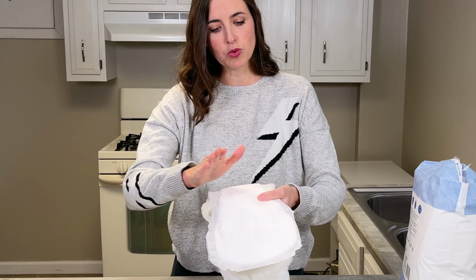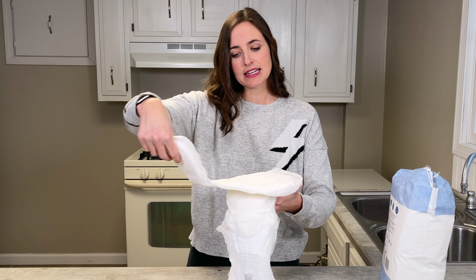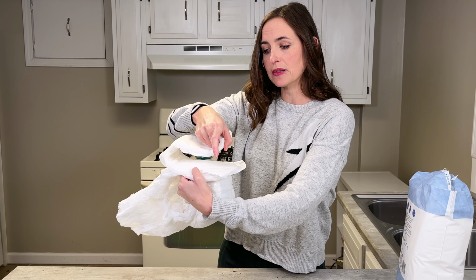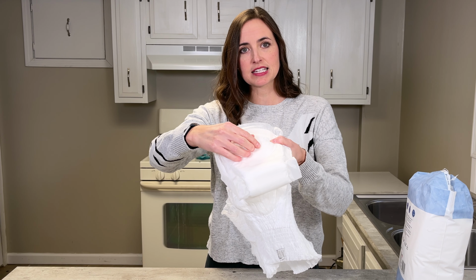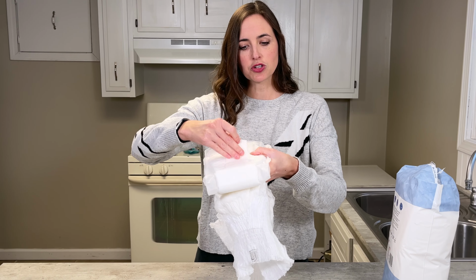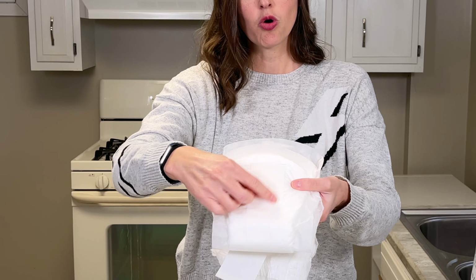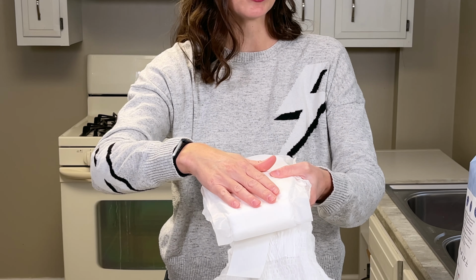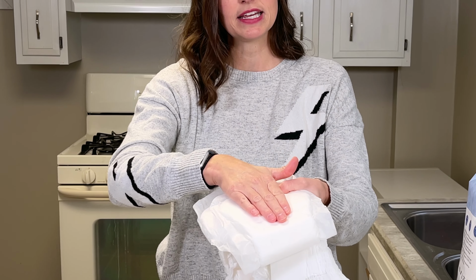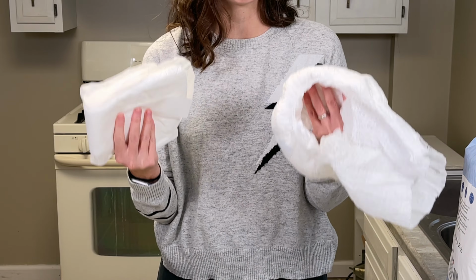And another thing that I've seen folks do with these is to really focus in on covering the tip of the penis while they sleep, by actually placing this in the front and wrapping it in this manner around the penis. Now, it's very important that if you do wrap like this, the wrap technique, that you are aware of where the sticky pad is. And what I've done in the past is, we don't remove all of the sticky, so we don't remove this whole thing. We just remove the portion that's going to be stuck down to the brief, because we don't want the adhesive to get onto the skin and cause discomfort. So what you can do then is either trim this off with a little scissors and just leave the rest of it covered. That way there's no adhesive getting onto the skin. So that's a way you can use this to really significantly reduce leaking, especially in our males during the night.